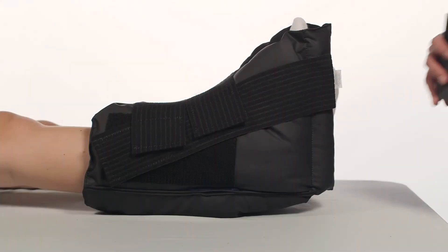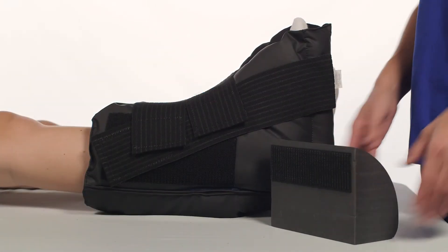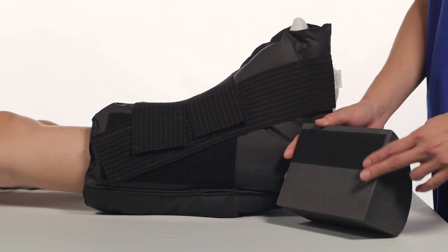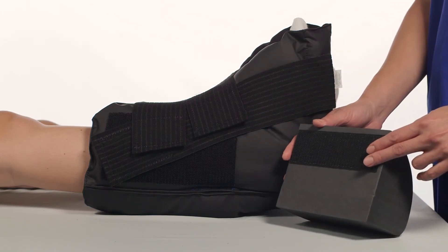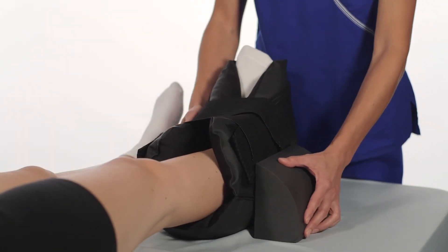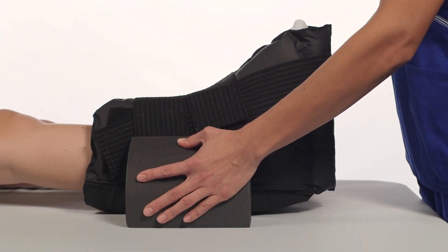To apply the anti-rotation wedge, make sure the boot is on the patient and the heel is suspended. While the boot is on the patient, place the hook side of the anti-rotation wedge on the outside, lateral side of the boot, making sure that the bottom of the wedge sits flat on the surface of the bed.